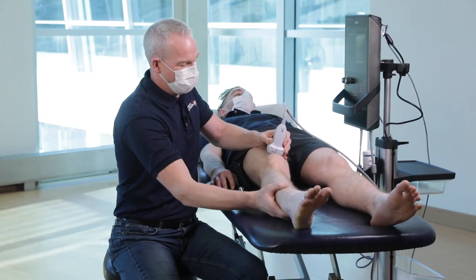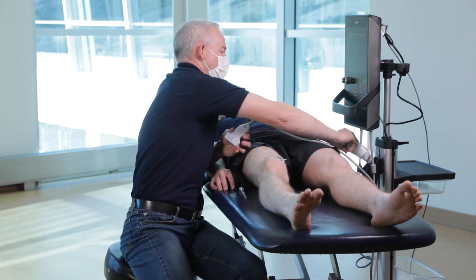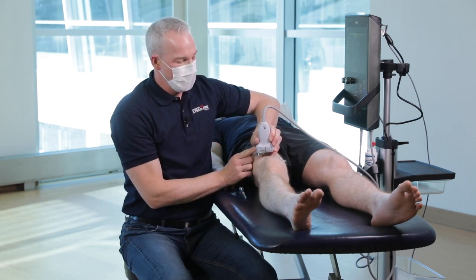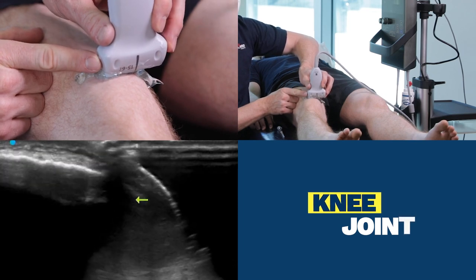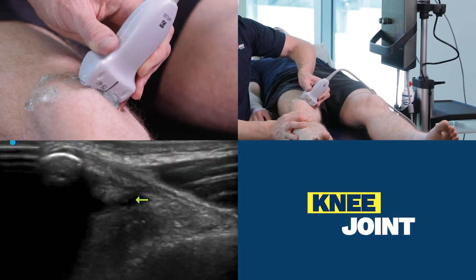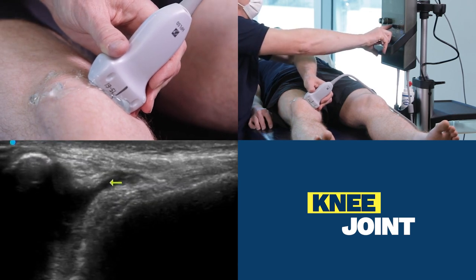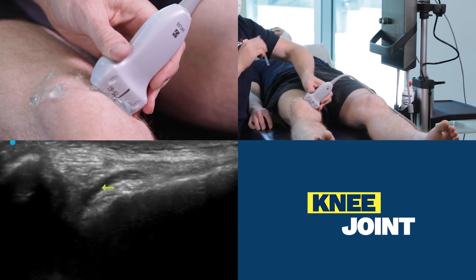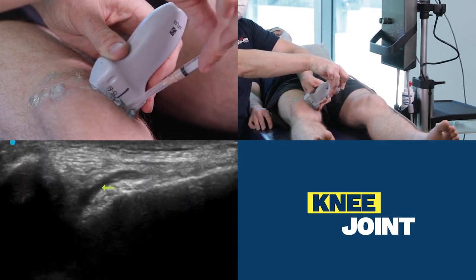We take the leg straight, we add a bit more gel, and we keep our probe with the same orientation. The landmark is going to be once again the patella, but now we're going to drop the probe onto the medial femur. We can see the hypoechoic knee joint fluid here, and to inject it all we have to do is drop our needle out of plane, like so, into the knee joint fluid.